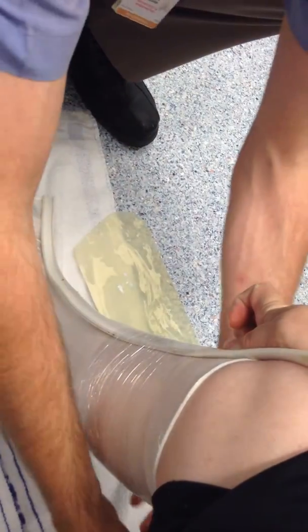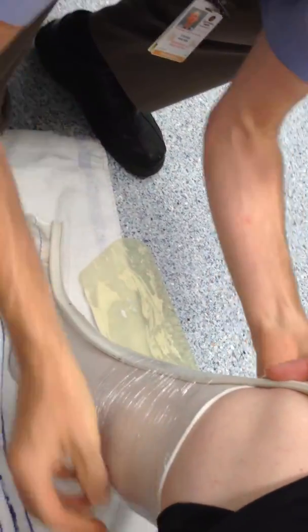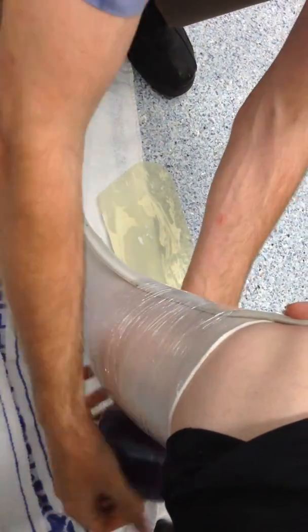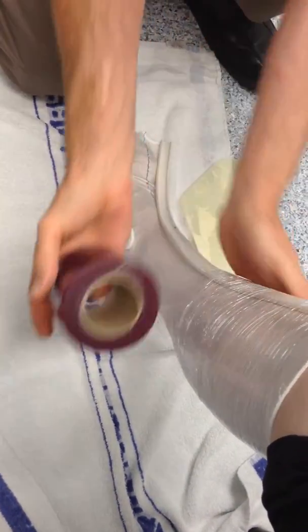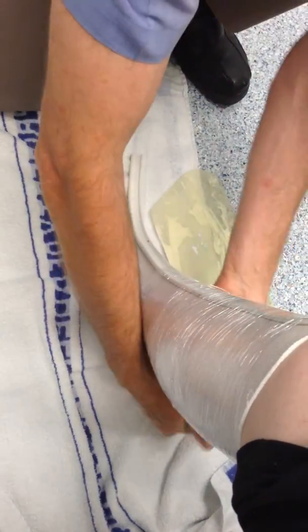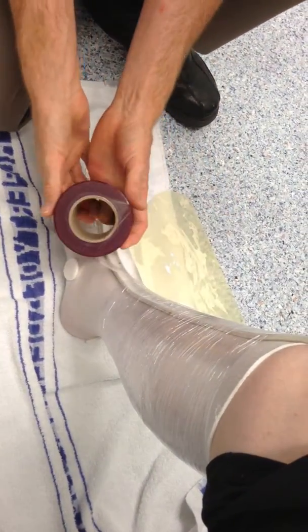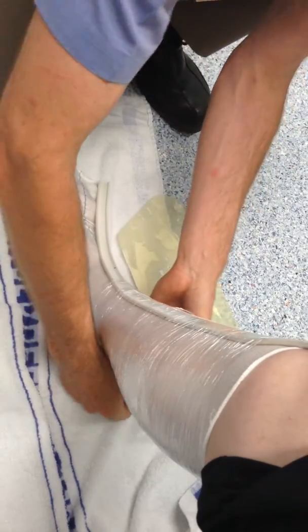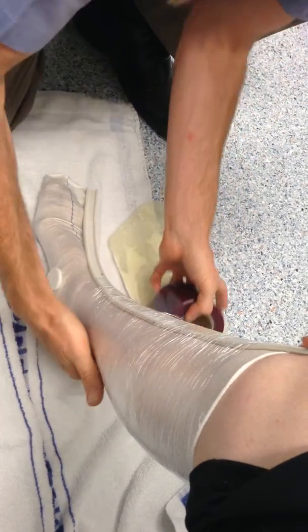Did we use plaster of Paris last time? They don't use plaster of Paris — oh, you do? We still do, but we've got this other stuff that I'm kind of getting used to now. It all changes over time. The one that we're using is glass fiber — fiberglass. So there are different ones, like plastic-y ones. We use this fiberglass one, which is pretty good stuff.